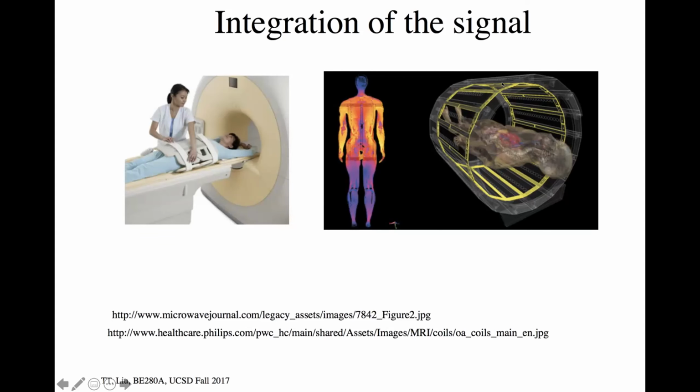It's a set of conducting wires in which the current is phase delayed around each one of these components, and it creates a magnetic field that, say, at one time is pointing out of the patient's chest, but then it rotates around the patient like this, right? And so at some time later, the magnetic field is pointing out their back, and then sometime later it's pointing out their side, and it's just rotating around, right? So that is the transmit coil.